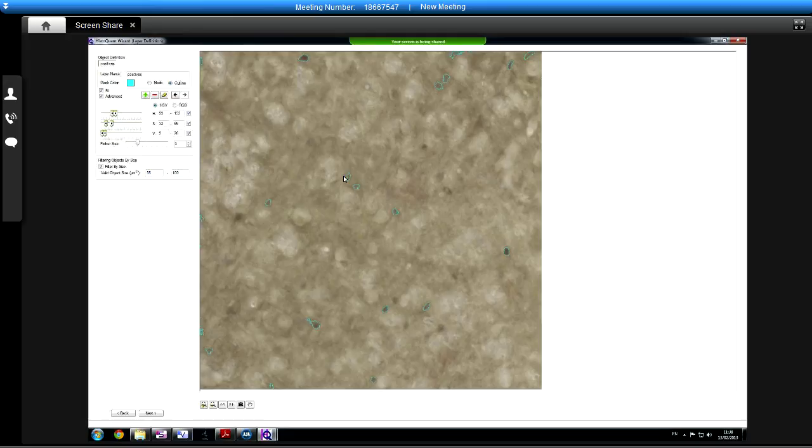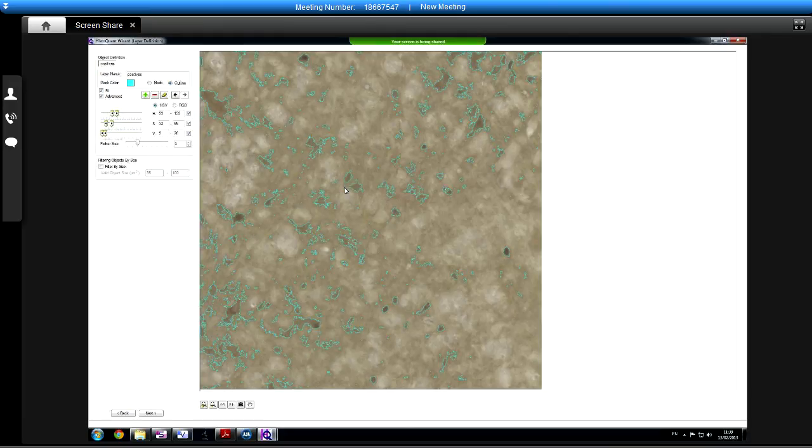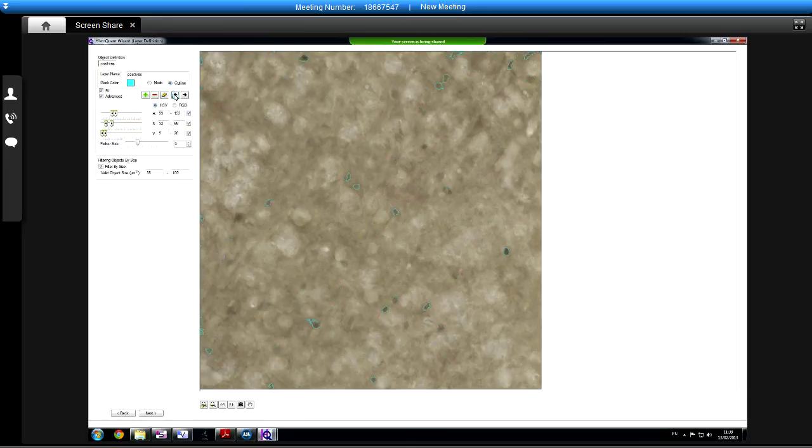The other question is should we be highlighting? Yeah, maybe we should just be changing the colour values to pull in a bit more around these. So, for instance, okay, that's got all the positives and a lot of rubbish. But if we do the size again. Yeah, okay. Now we're getting things like this, where we've gone too far in the colour there, I think, haven't we? So let's just go back a step. So actually, at that, do you think the error rate there is fairly low on that area? I think the next thing to do is obviously to try on a bigger area to see how far out we are.